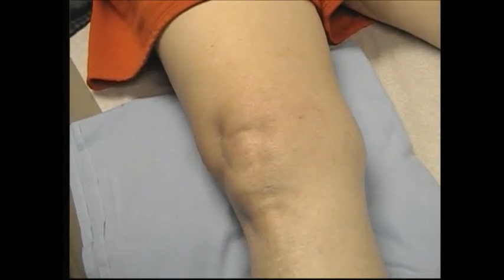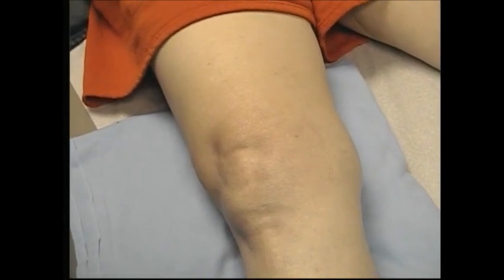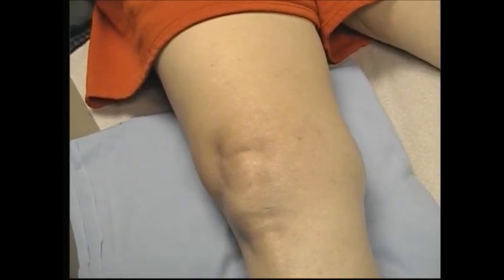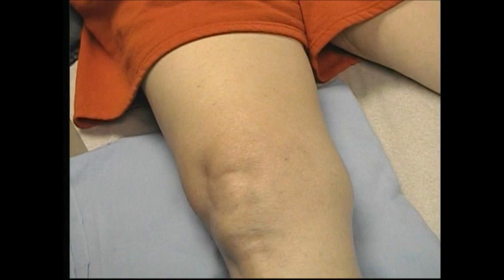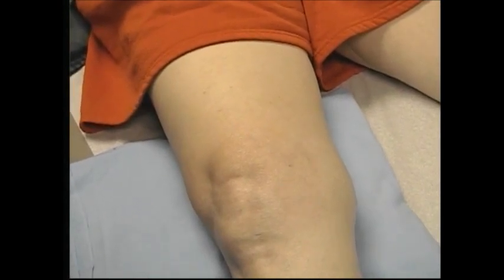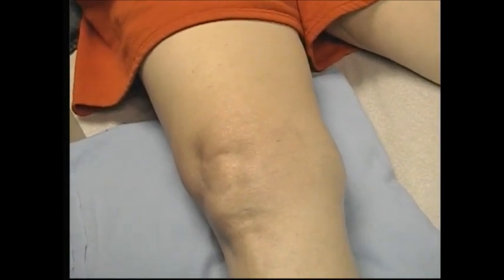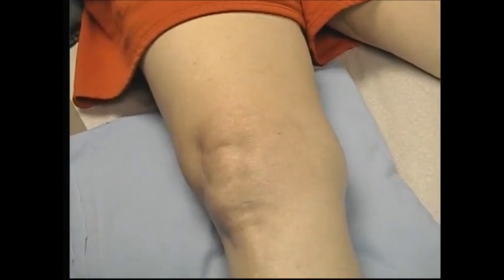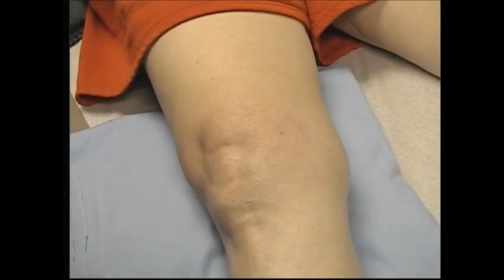She's had recurrent effusion of the knee — probably between a 2-plus and a 3-plus effusion. For effusions, it's better to aspirate the knee from the lateral side, where you can feel the IT band. You'll find that there isn't quite as much synovium just on the other side of the IT band, so the fluid can be extracted a little bit more easily, and you don't have a problem with the needle being filled with synovium.